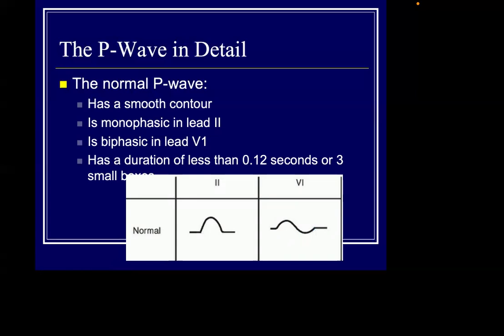The first initial portion is due to right atrial depolarization. And the next negative deflection is due to left atrial depolarization. We say that atrial depolarization will be manifested as a P wave in the ECG. Where is atrial repolarization? We say that atrial repolarization cannot be assessed by the ECG, and usually we do not see it in the ECG.